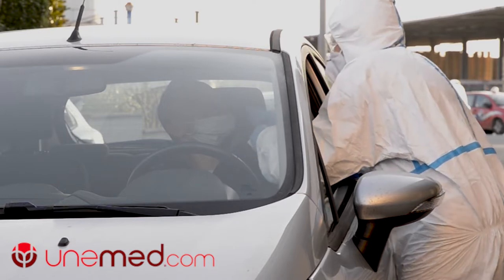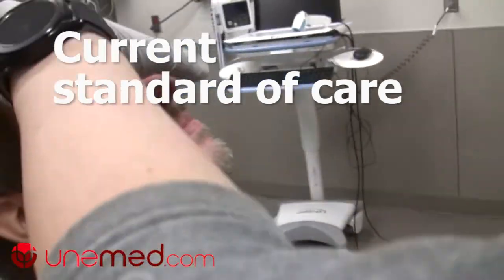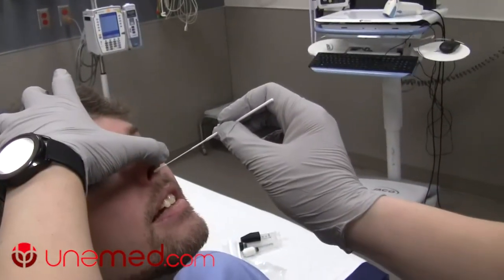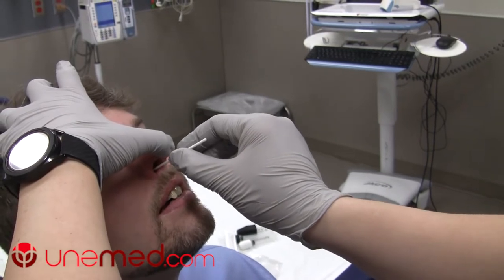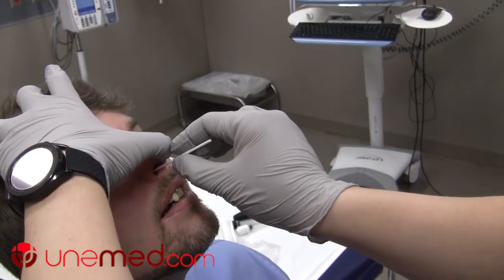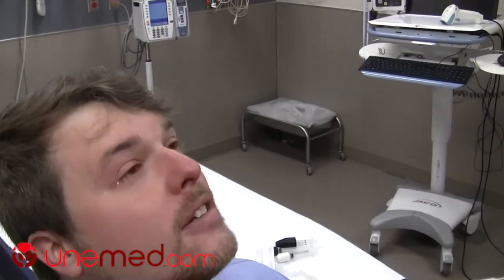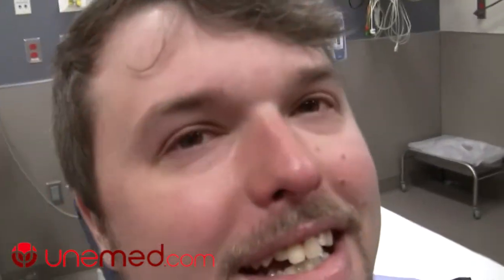The process is: you have this cotton tip — it has a fibrous tip. You have the patient lean back a little bit, flex their nose, and you take the swab and walk it along their nasal floor until you hit resistance, which is right about there. Some will twist for about 10 seconds, some will press for up to 20 seconds, and then you retract back. Depending on the site, they may do it again on the other side to get a good sample.